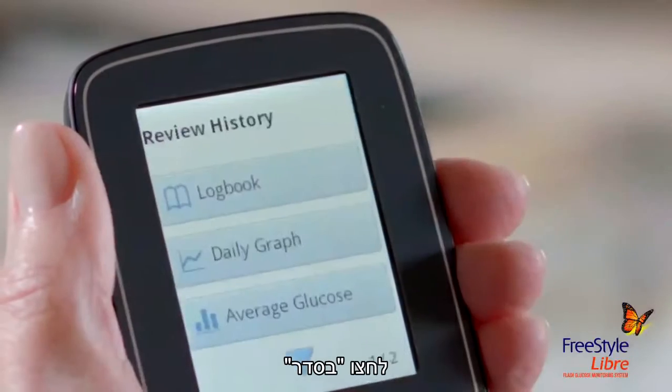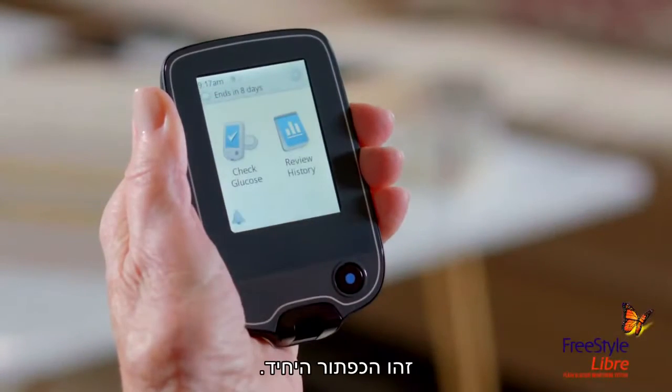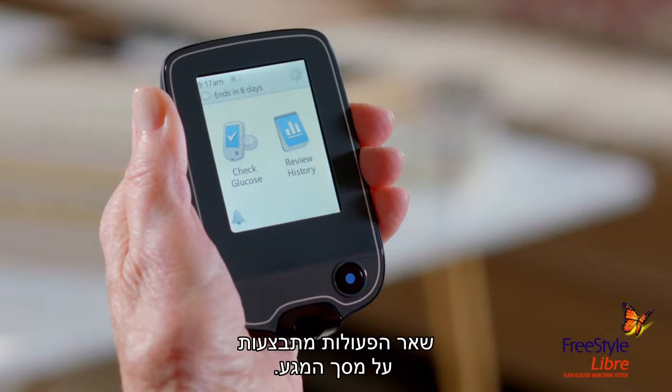Tap OK, then press the blue home button to return to the home screen. It's the only button. All other actions are done on the touch screen.